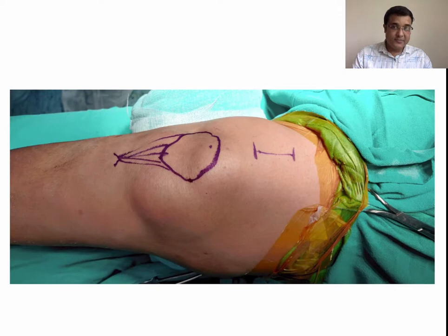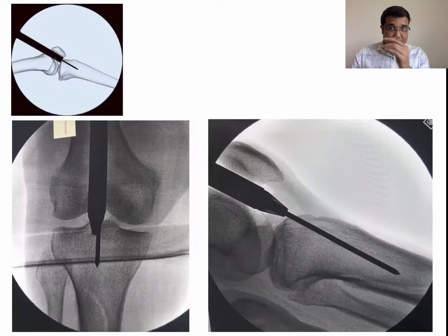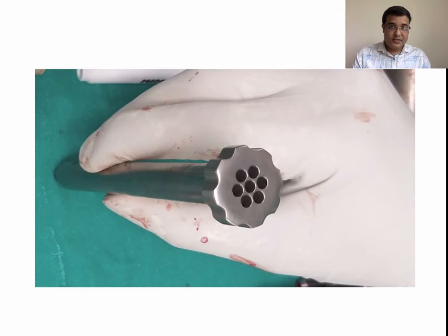Boundaries of the patella were marked using a skin marking pen. A 3-centimeter long longitudinal incision ending one centimeter proximal to the superior pole of the patella was made. The quadriceps tendon was incised along the length of the skin incision, following which a protective cannula was inserted through the retropatellar space. Entry was made just medial to the lateral tibial eminence in AP view, in line with the anterior cortex and intramedullary canal in the lateral view. The guide pin was then passed and kept in place.